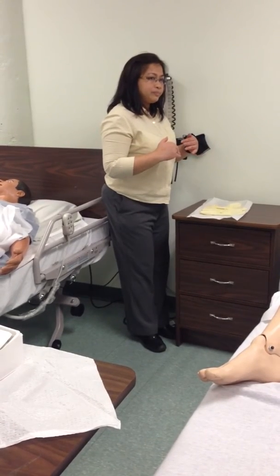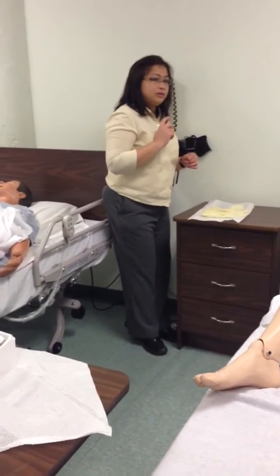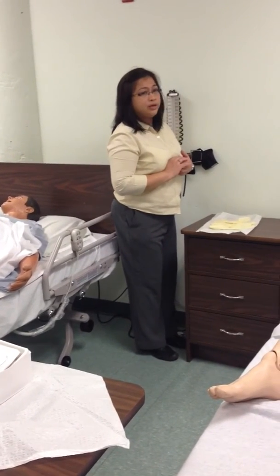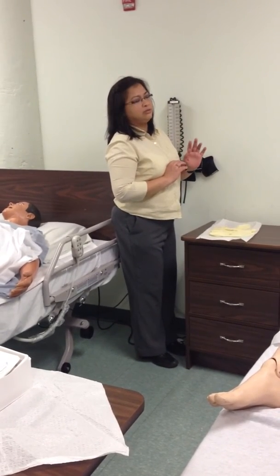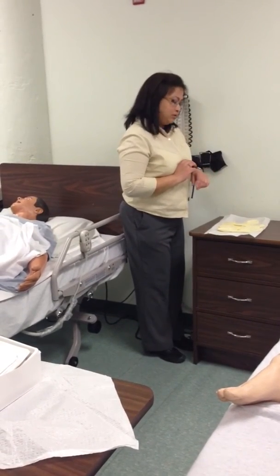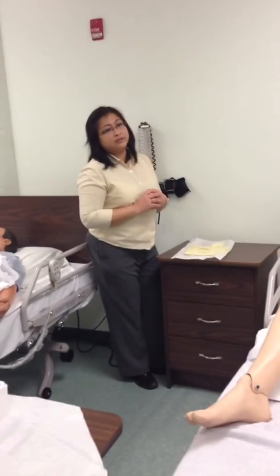So we do the sides. Okay, so remember I told you before that if you contaminated a sterile thing or sterile part, you need to verbalize that I'm gonna throw it away and get a new one. You just verbalize that, I'm sure they will tell you, just go on. As long as you mention that or you verbalize that, as long as you mention your mistake, because you cannot assume that they did not see you.